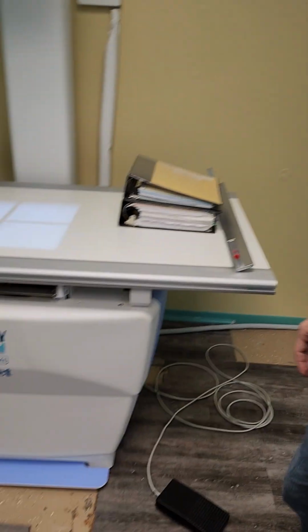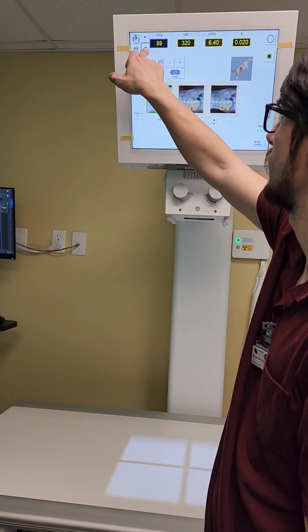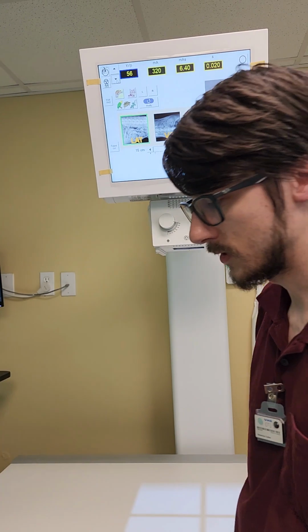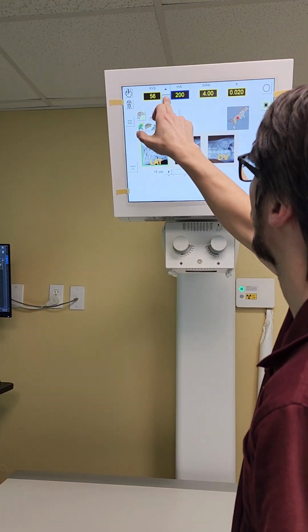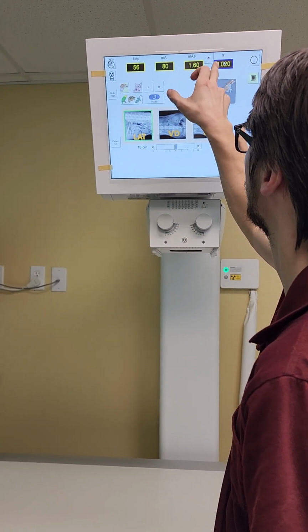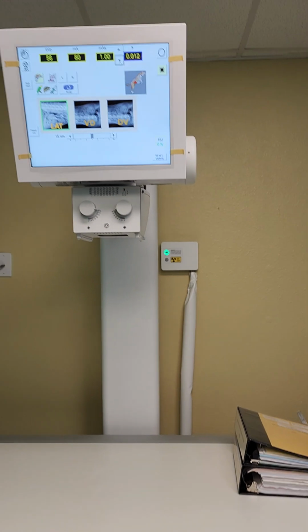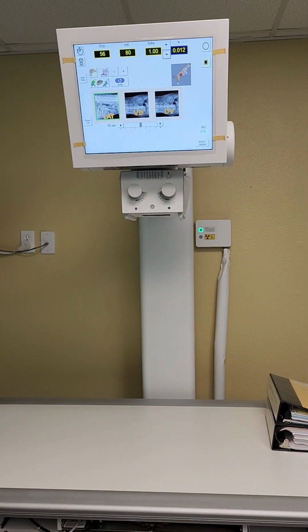And then, let's see, I'll just turn it down real quick, and then we'll do a quick shot, just so you can see what it looks like over there, and I can show you some of the image changing stuff. How fast is fine. Alright, y'all mind if I show you a shot? I know some people like to jump out of the room.